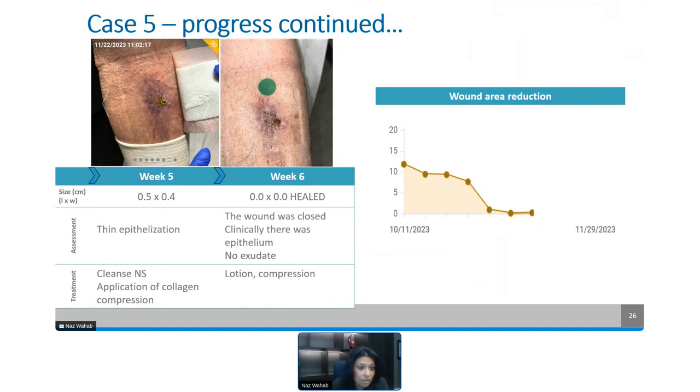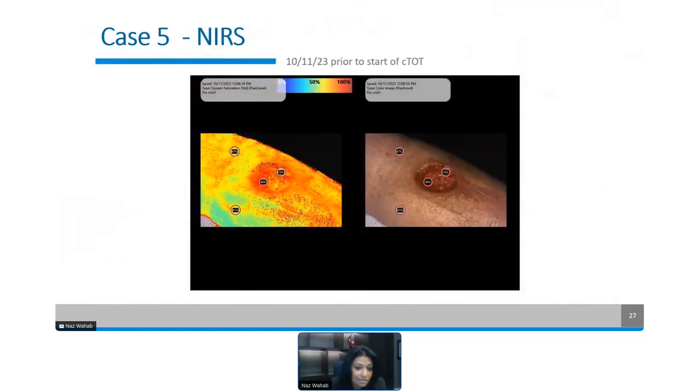Now, again, we had been working on this wound for 12 weeks prior, and we got more out of 6 weeks than we did out of the 12 weeks prior, despite doing all the right things. And so I think there is a huge use case in using topical oxygen and the CTP in succession. I have not yet used topical oxygen on top of a CTP, but again, thoughts on perhaps that might work.